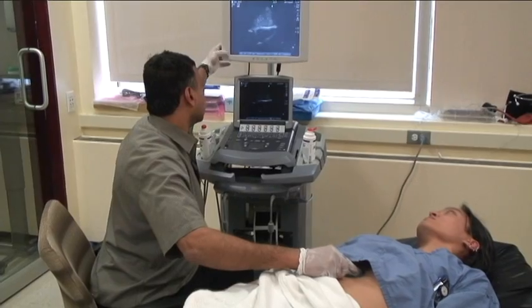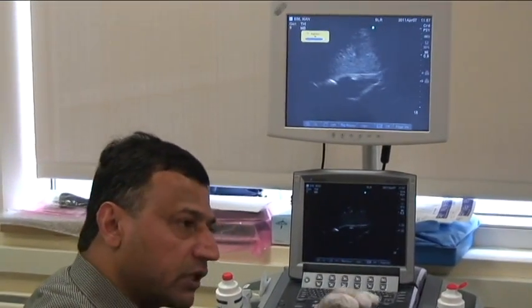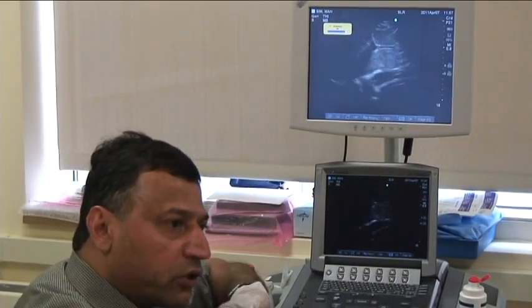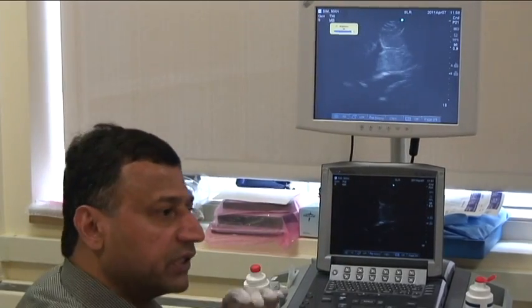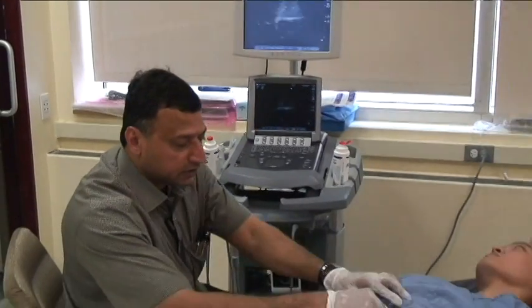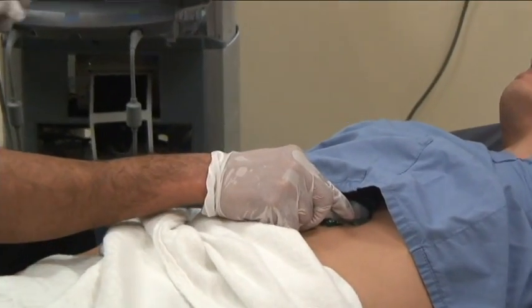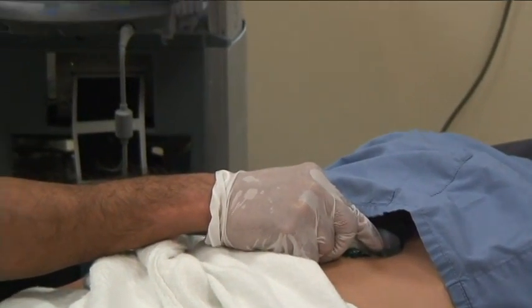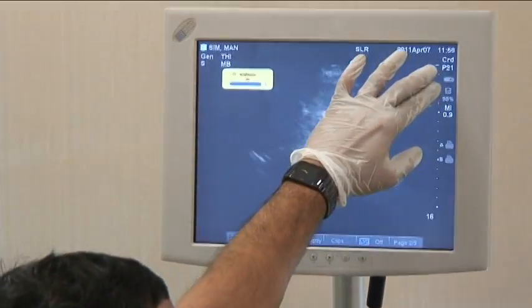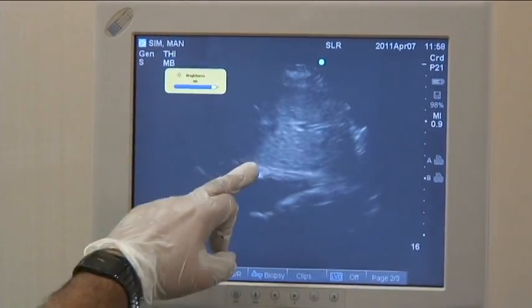what you will see here is in different patients, you might have to do a different thing because the heart position varies. If you have somebody with emphysema, it's like a teardrop heart, the whole entire axis changes. If somebody is obese, the heart lifts up a little bit. So there's no one way, but if you just place it at the subxiphoid area with your probe pointing to the left, and then notice here again, I have to play with the depth because I have the heart, but I'm seeing at least about, each one here is 1 centimeter, so I'm seeing at least 7 centimeters of liver, and then the heart stops.